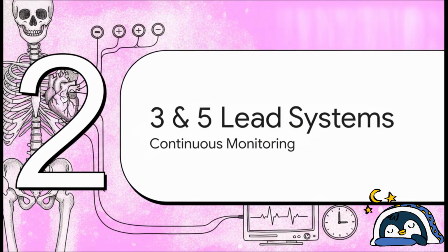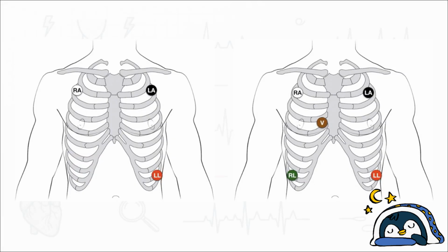Moving on to section 2, 3 and 5 lead systems. Transitioning from basic anatomy, let's check out the simplest continuous monitoring systems we use in the hospital, basically every hour of the day. There's a really elegant progression between these two.